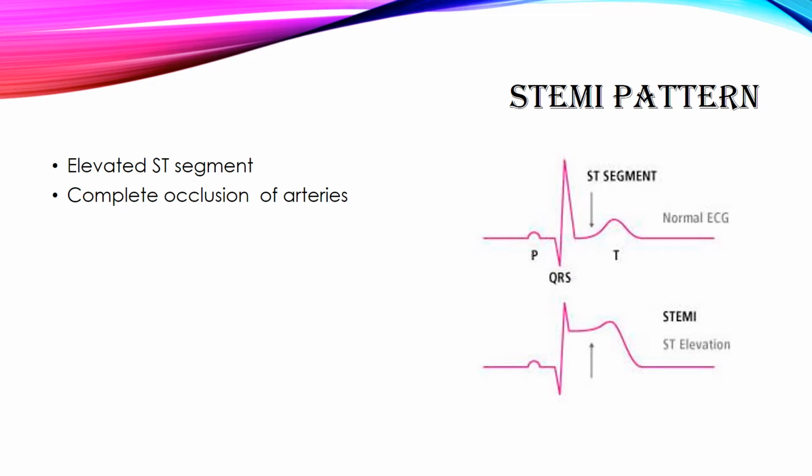A STEMI pattern, on the other hand, is when you have an elevation on the ST segment. This is when you have a complete occlusion of the arteries.